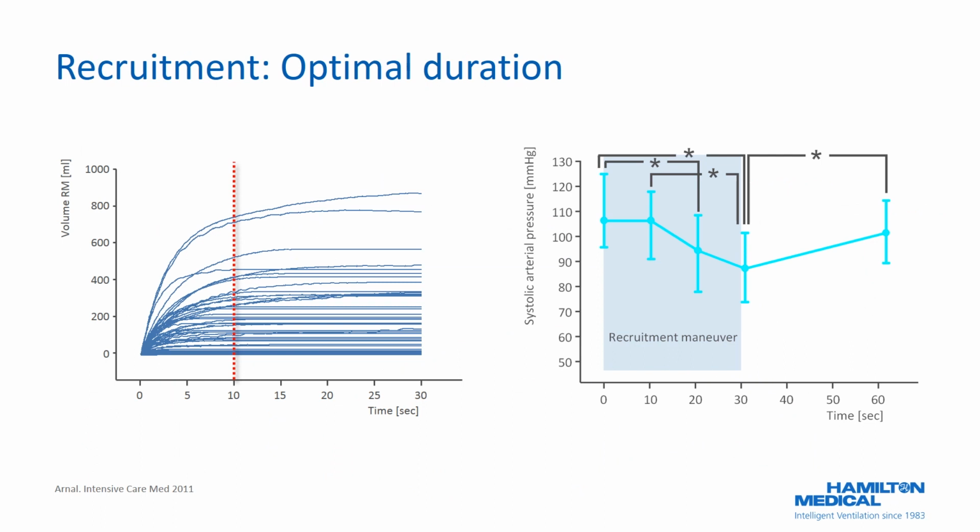In this study, a sustained inflation recruitment maneuver at a top pressure of 40 centimeters of water for 30 seconds was performed in 50 ARDS patients. Dynamics of recruitment were measured. Each line represents one patient. Some patients did not recruit. Some patients recruited from 50 to 800 milliliters.